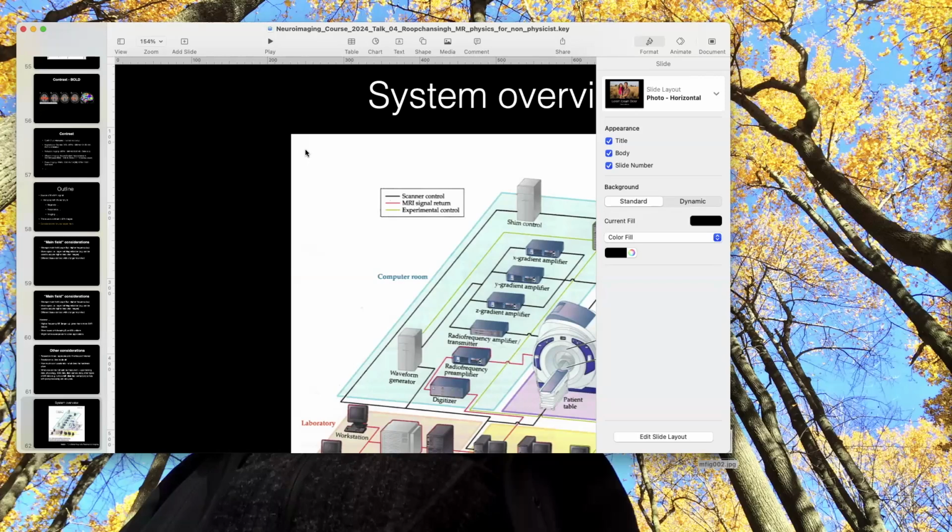So one is noise in the system and essentially in the technology. We can only drive our amplifiers so fast. We can only put that much power through our RF hardware. We can only detect that small of a signal before thermal noise starts introducing its own fluctuations into that. So if you're imaging a very small, tiny voxel, there are fewer protons and species in there to generate magnetization for you to detect.